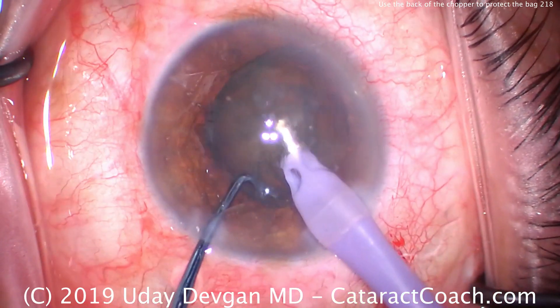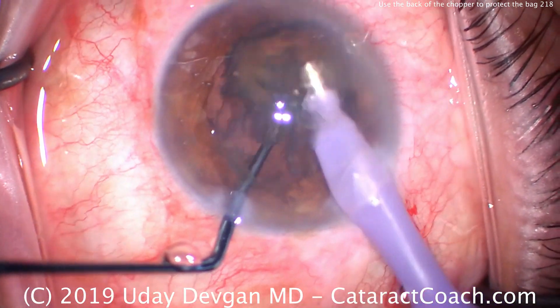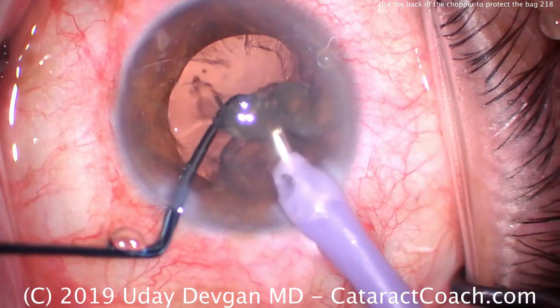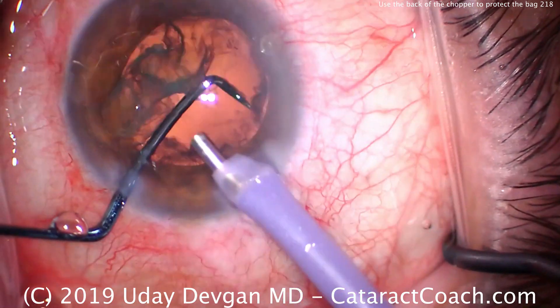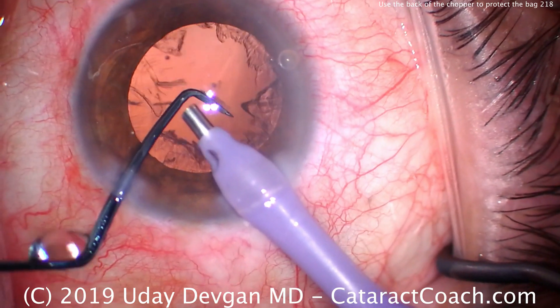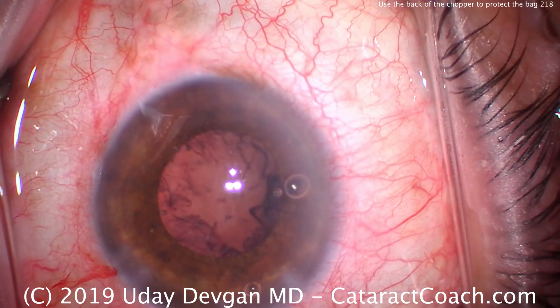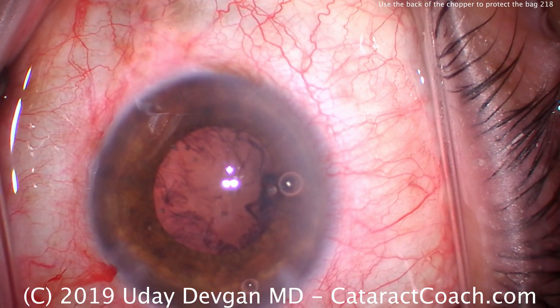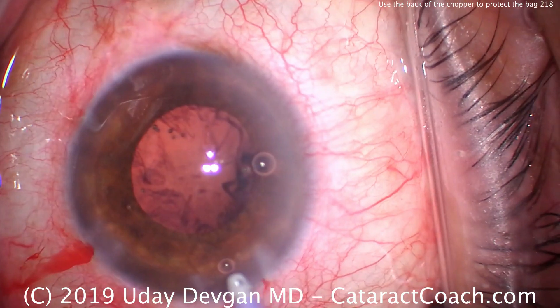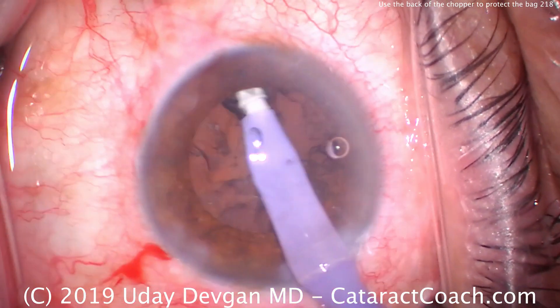Half is removed; here's the second half coming up. Now I don't need more chopping, so the chopper initially pushes the piece in front of the probe, and now the smooth backside of the chopper — not the tip — is against the posterior capsule. You'll see that the posterior capsule will come up and touch the back end of the chopper. It's very important that we use the chopper to block the posterior capsule from coming forward so it's not able to touch the phaco tip. If it touches the metal phaco tip, it can certainly break, so we're very careful about that.